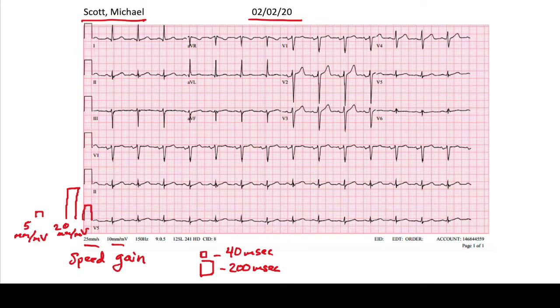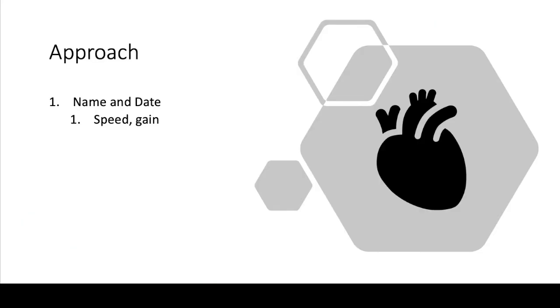Sometimes there's a third value called the filter. The filter eliminates background noise in the EKG — mainly from patient movement — which allows us to have clean EKG tracings. So those are the first two steps of reading an EKG: check the name and date, then quickly glance at the speed and gain. Once you do that, you can move on to reading the rest of the EKG.